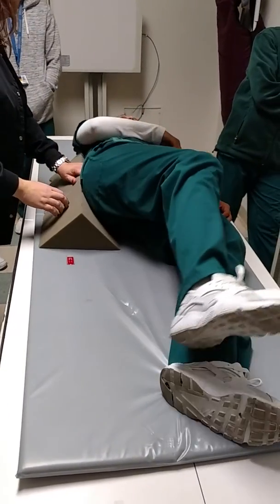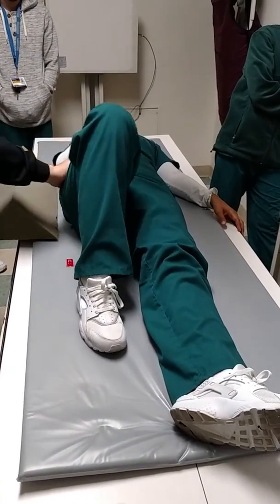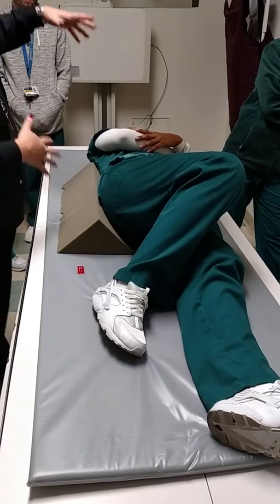Oh, you just did the little hip scoop. Ma'am, we're going to start this again, okay? You're going to lay flat on your back. We're going to bend this leg and just roll. Don't scoop. Okay, lay back. Old people do that all the time. They throw their hip out. Now it's all out of whack and you have to start over.